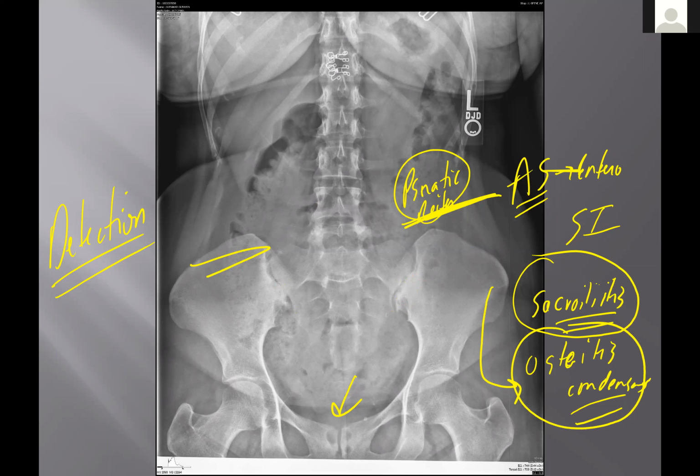Thank you. You bet. Any other questions on this case? Great case. Great case. Chiropractic case. All right, let me give you a couple extremity cases, or one extremity case.